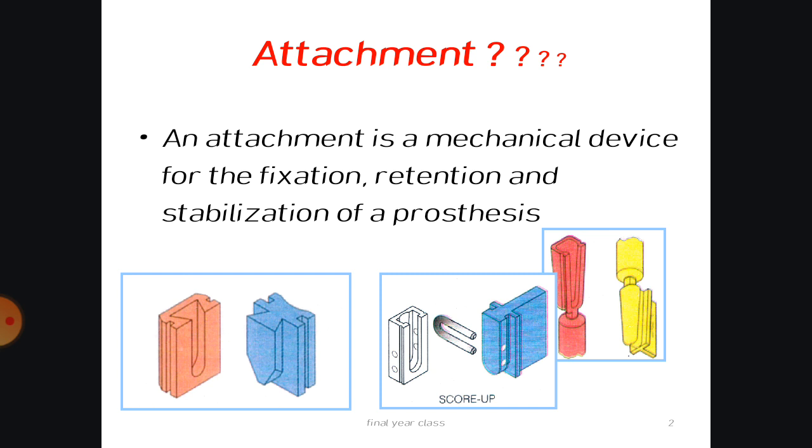But the commonest disadvantage is the difficulty in fabrication, the cost of maintenance, and the periodic checkup the patient has to undergo, which will be quite more in number compared to the normal RPDs, which we fabricate using clasp and direct retainers. So these are the setbacks and advantages.